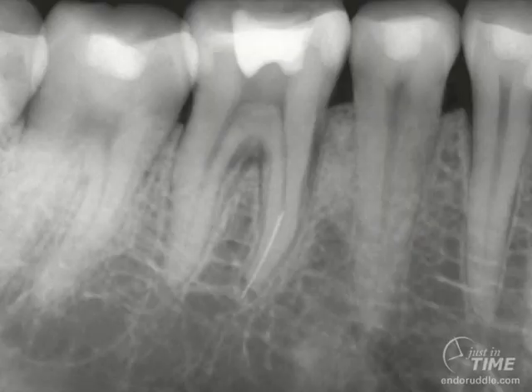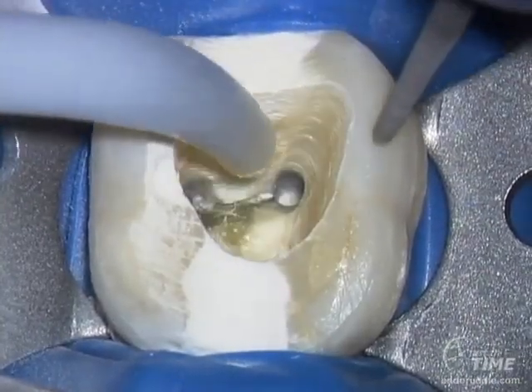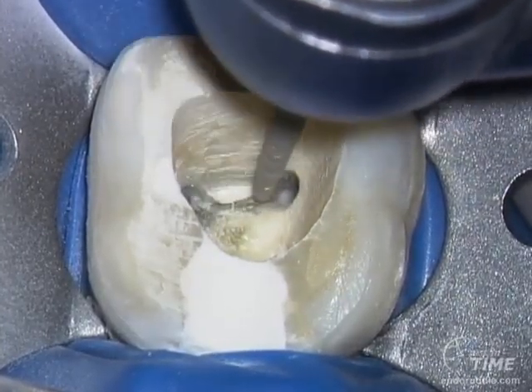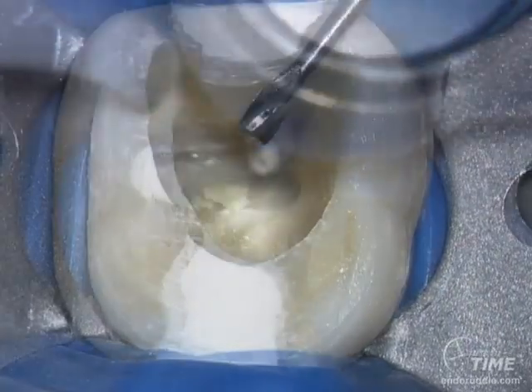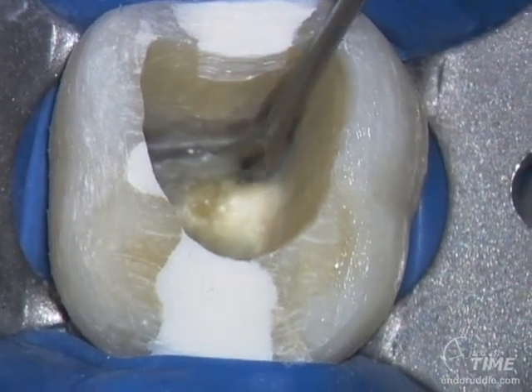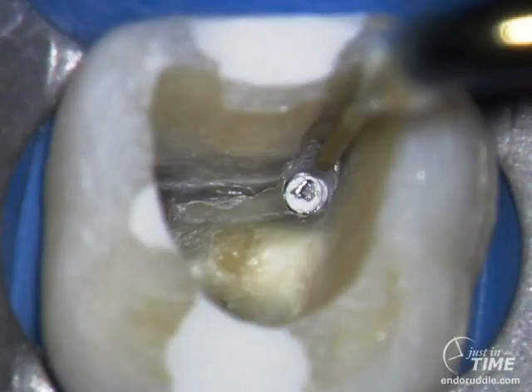On this first mandibular molar, it's almost invariable that we as specialists will go back and modify the access even a little bit more. Notice the furcal lesion and the position of the broken instrument — the mesial root is quite thin and we should expect a furcal side concavity. Once we have isolated the tooth and removed the provisional restoration, it's almost invariably necessary for us as endodontists to re-modify the access cavity to facilitate the removal effort. After using the four, the three, and the two Gates-Gliddens as previously described, I'm showing you a modified GG2 — this is what creates a staging platform. Look at the remarkable clarity and the visual acuity of this broken instrument with a staging platform.